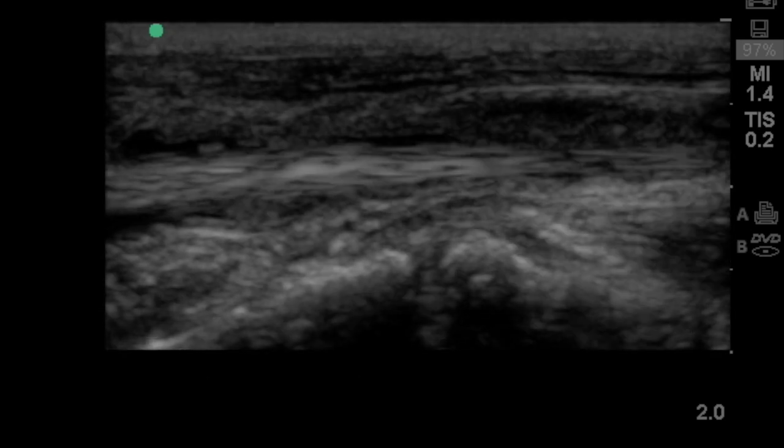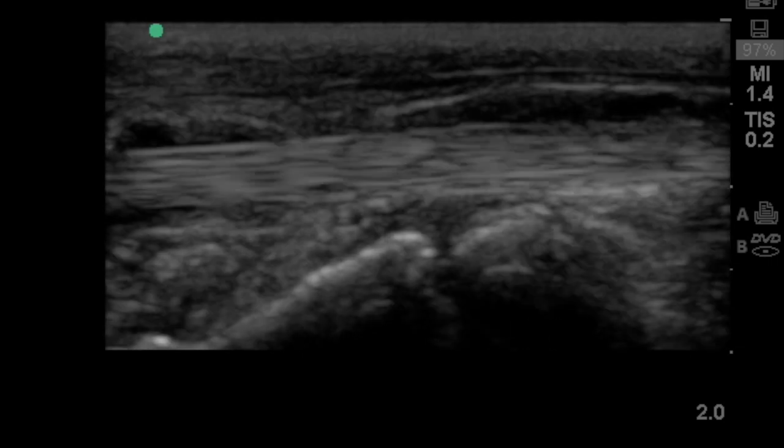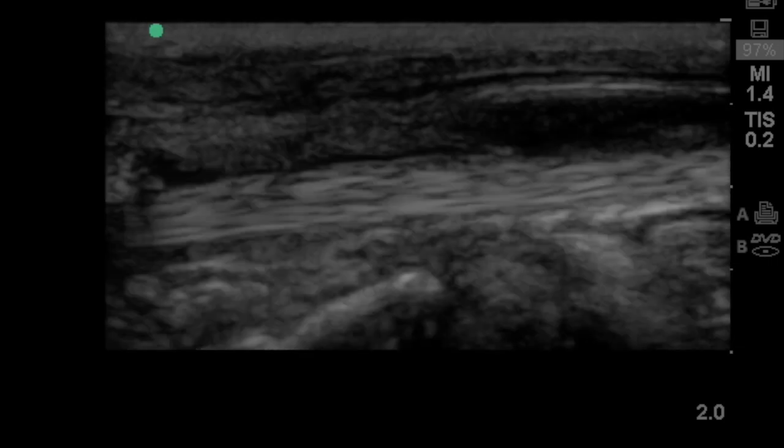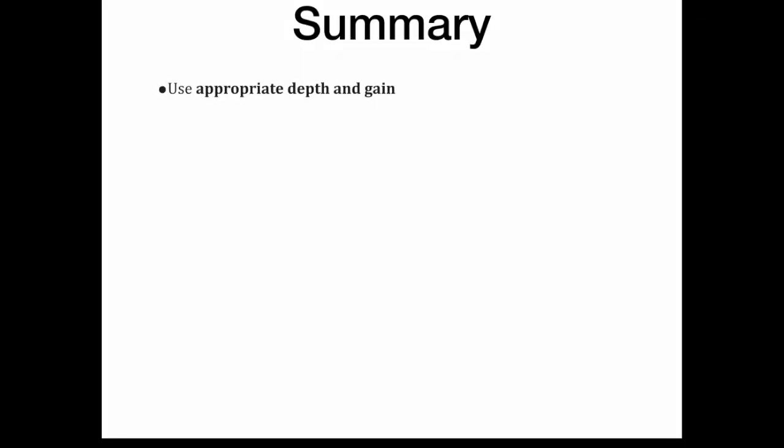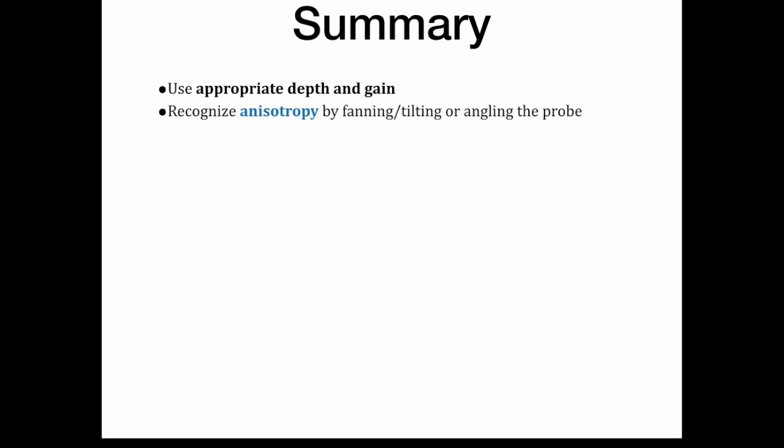This is one example of pathology you can find on ultrasound: flexor tenosynovitis, which is due to inflammation or infection of the flexor tendon itself. You can see fluid in the sheath.